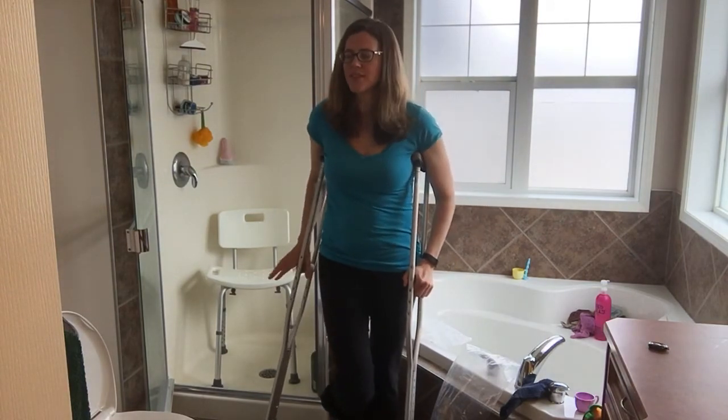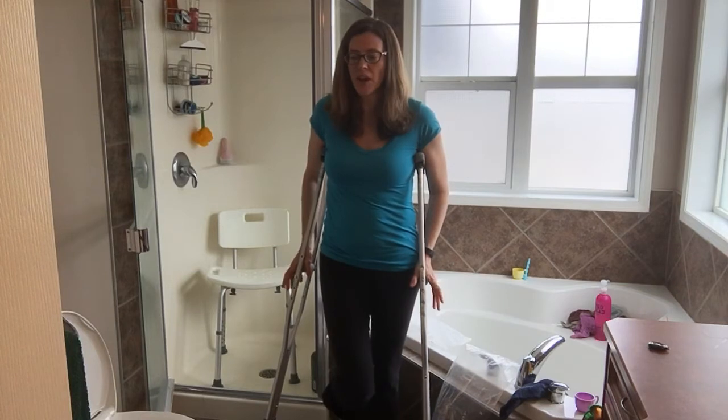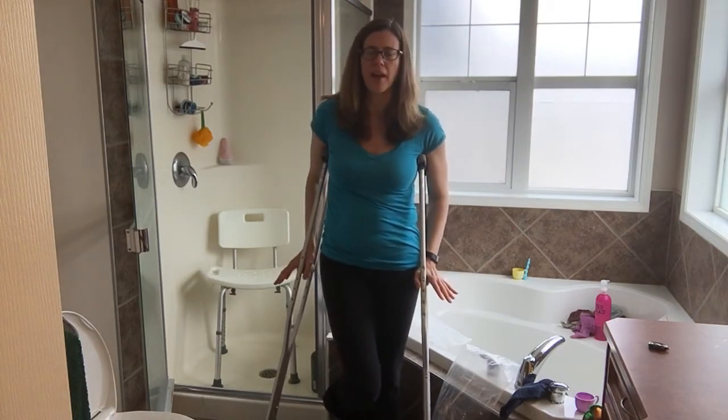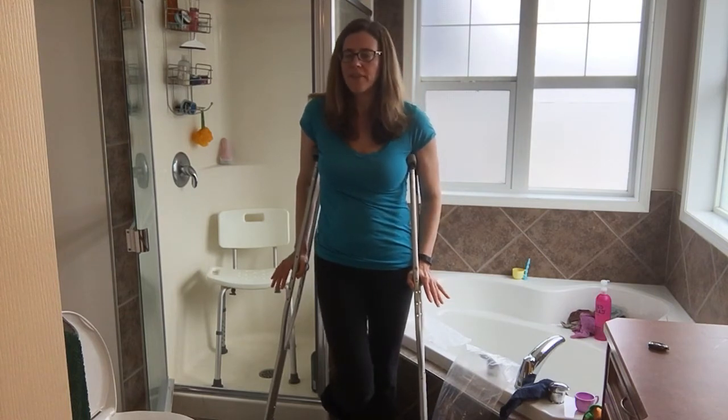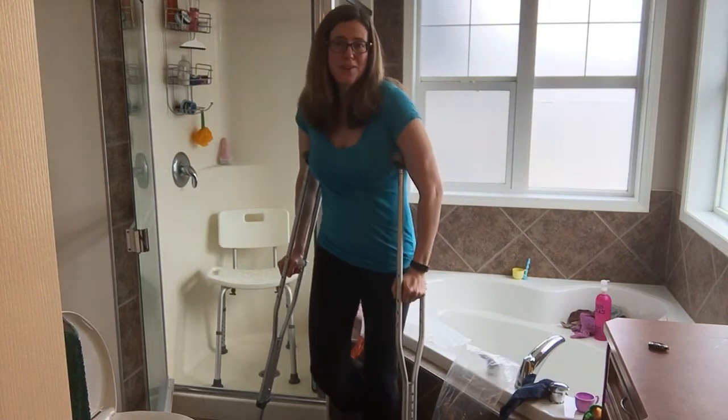Getting into the shower, it's just easier to have a seat — it takes a lot less energy. You can stand up in the shower if your balance is pretty good and your shower is small enough to put your hand on the wall, but it is a slippery area. I just find it easier to sit, and I like showers, so I don't like to be quick.